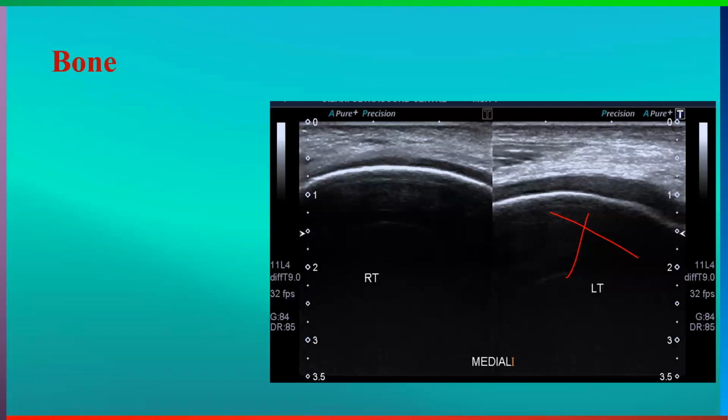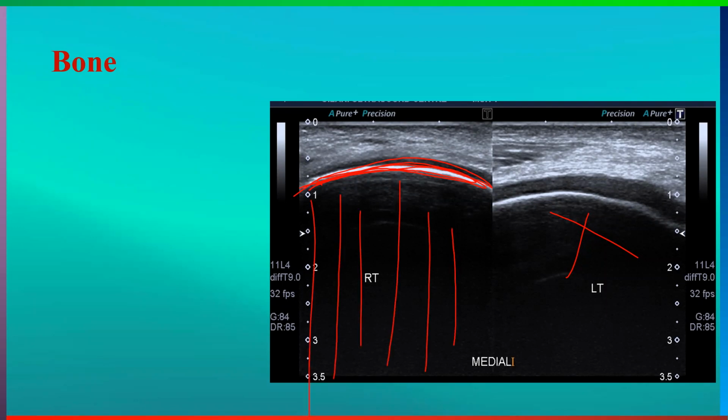So with that absorption, the deep bone will disappear. It won't be appearing on the ultrasound machine, right? So in the case of bone, you can see only the cortical part of the bone as an echogenic line, but the deep part of the bone will not appear, right? This is a black area behind this bone, and you can term this an acoustic shadow as well. But this is a huge acoustic shadow. That's why you can't differentiate it from other structures.